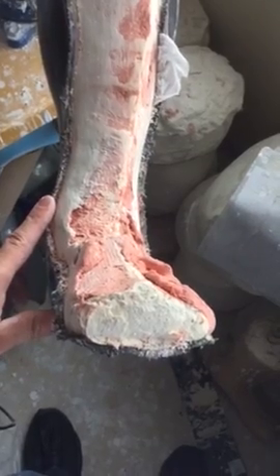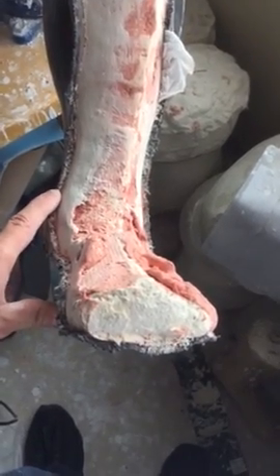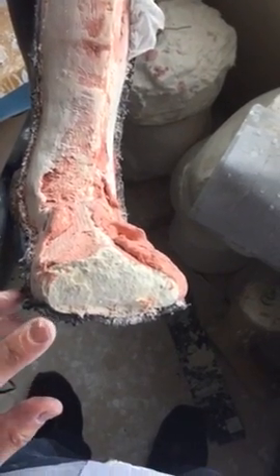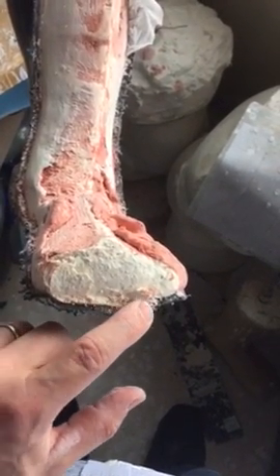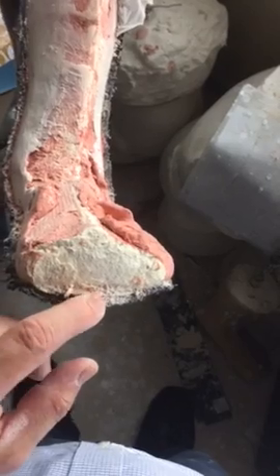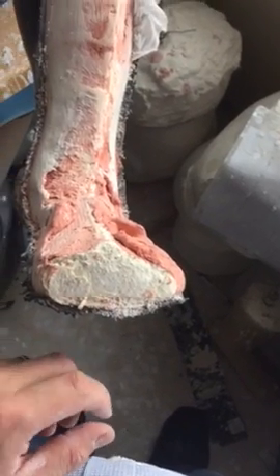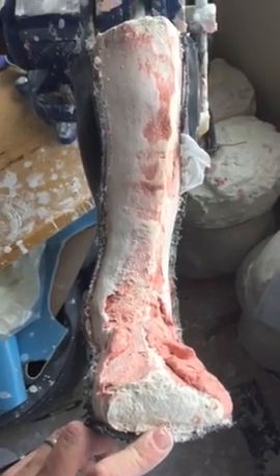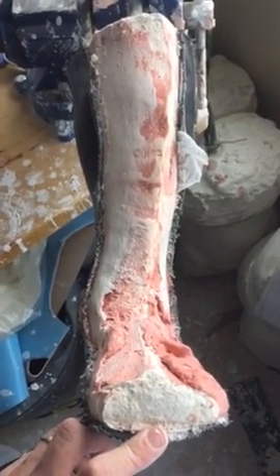We use three different sanding cones: a rough one, a medium, and a fine one. We end up smoothing this all down and making this not a bullnose, so somebody doesn't feel that edge. That is all part of the fabrication process and making an AFO.